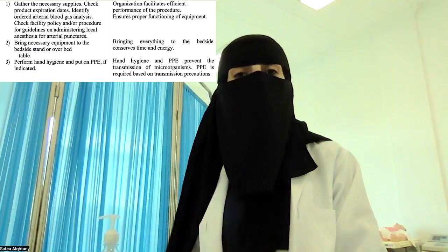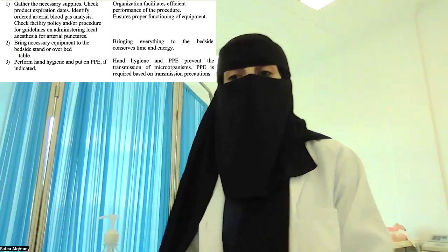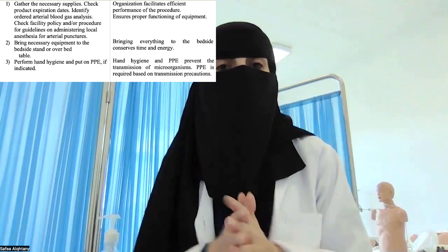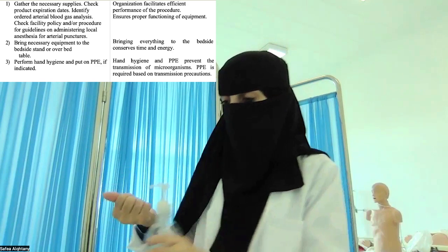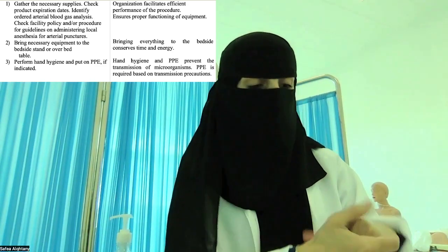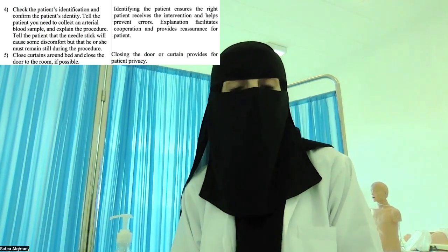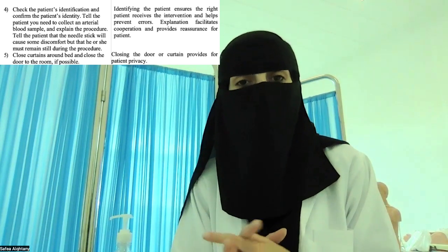After I prepare all my equipment, I need to bring all the necessary equipment to the patient bedside over bed table، يعني أضعها على الطاولة التي تكون بجانب المريض. And then I need to perform hand hygiene using alcohol-based hand rub, or I can use soap and water. It depends on what's available. After that, I need to identify the patient to make sure that the right patient is receiving the correct intervention and prevent any error that might occur.